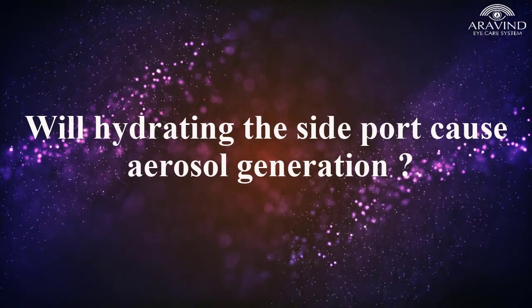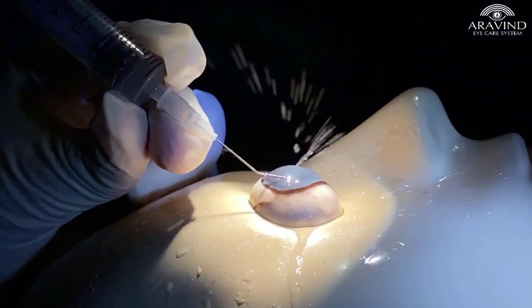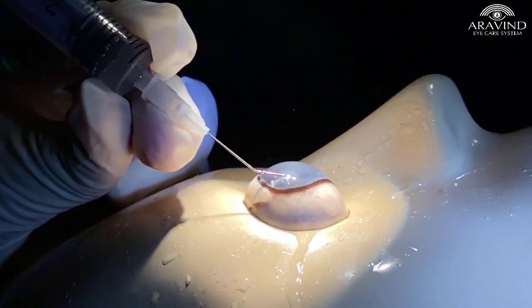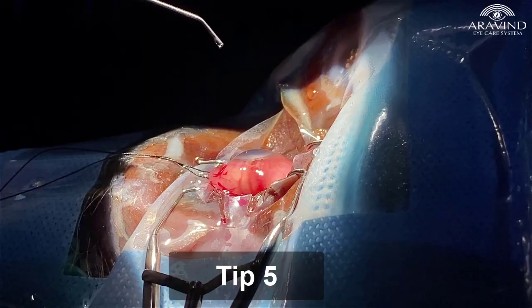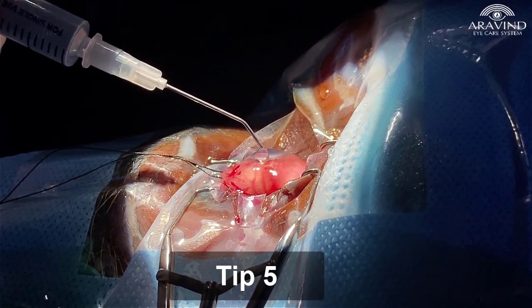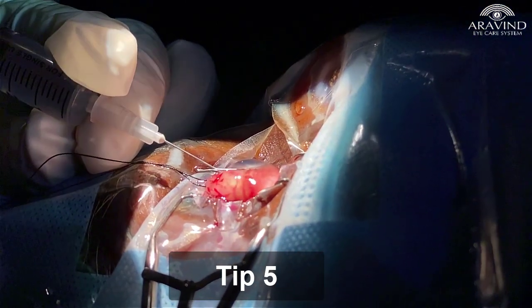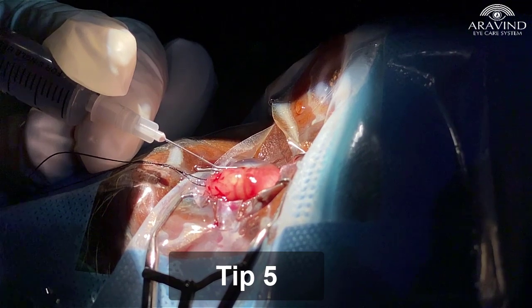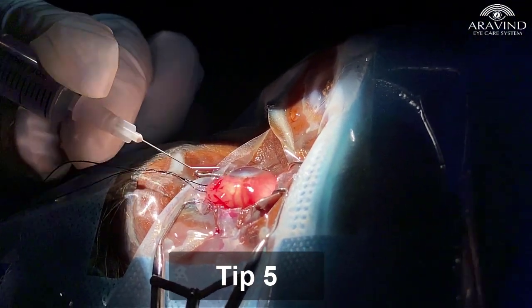Will hydrating the side port cause aerosol generation? Yes, as you can see, aerosols are generated while hydrating the side port. We can avoid it by using viscoelastics over the wound area, injecting fluid for hydration only after correct positioning of the cannula, and stopping the hydration before bringing the cannula out.